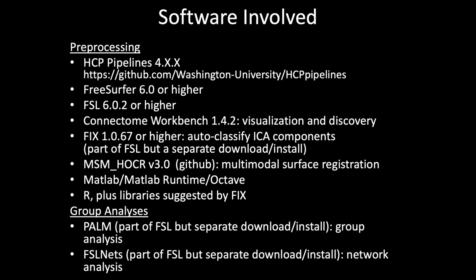FIX, which is that denoiser tool by FSL that is meant to auto-classify your ICA components. Although it's by the FSL people, it's a separate install and is dependent on using MATLAB or MATLAB Runtime or Octave for some of its processing, as well as a number of R libraries in R. I can tell you that it is a pain in the neck to get FIX to run initially.